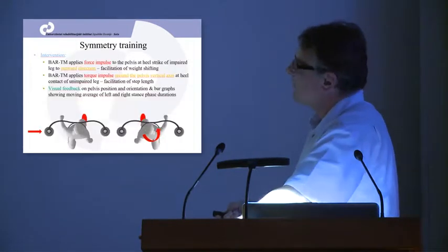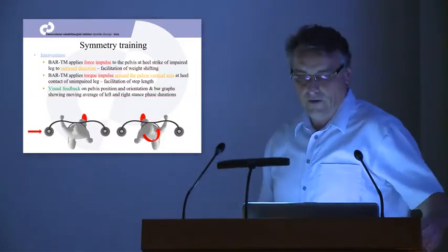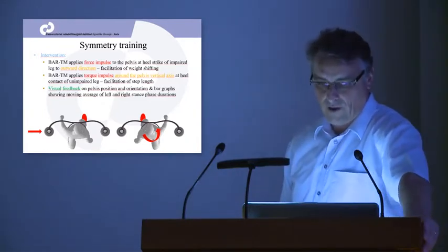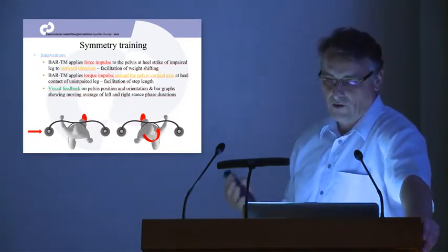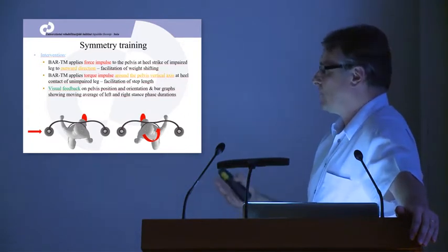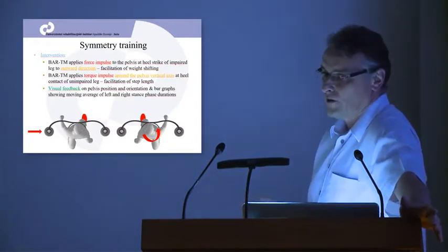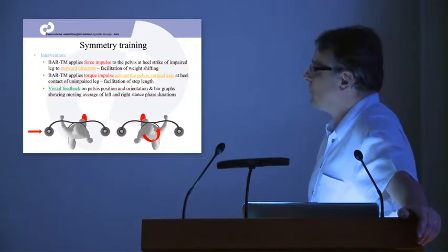So if we look now a little bit at the underlying philosophy or approach. What we can do with this device is, like mentioned before, apply force impulses of different duration depending on what the objectives are. That also depends on the particular deficiency of a particular patient. There may be different approaches that will work in one patient, but in other patients it will not work. So this is something that needs to be tried and tested.